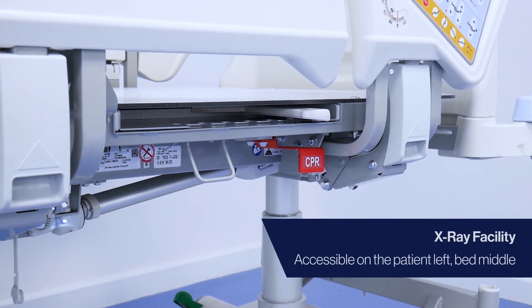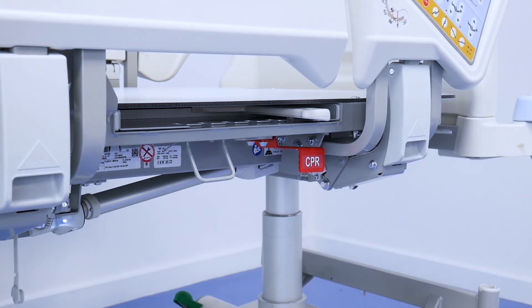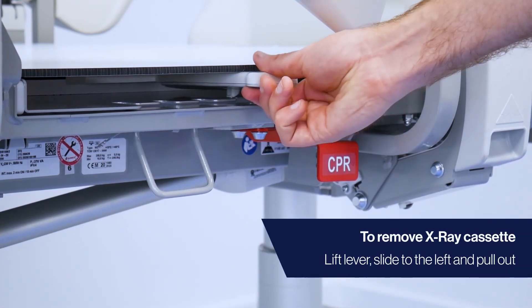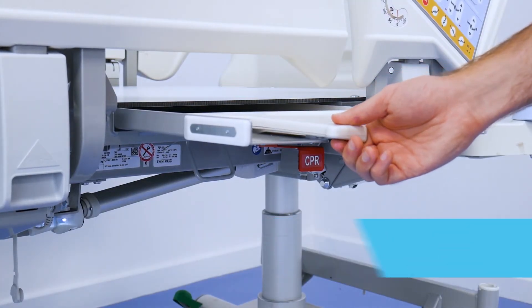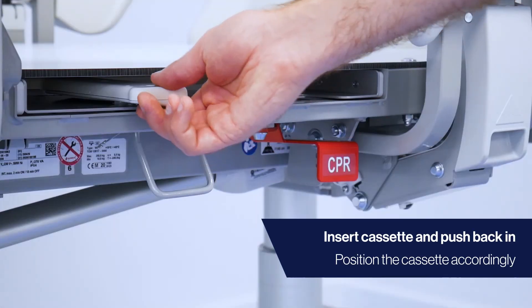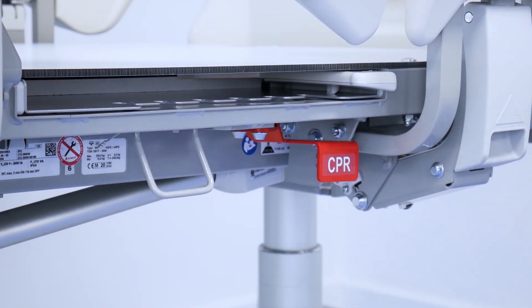To utilise the x-ray facility, position the patient in the centre of the bed. The x-ray cassette is on the patient's left in the middle of the bed. To pull out the cassette holder, lift the lever and push left until it stops, then pull the holder out. Insert the cassette and push back in. Remember to position the cassette holder so the upper edge is under the patient's shoulder line.